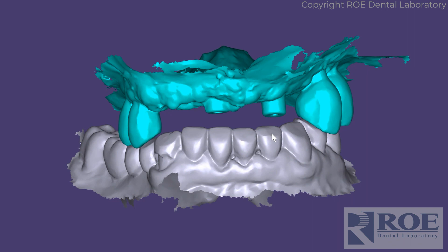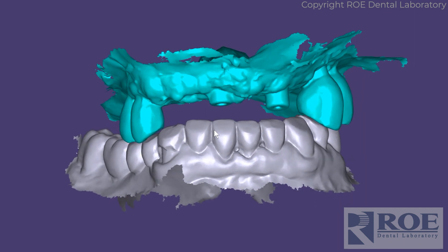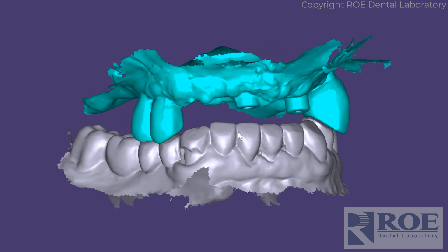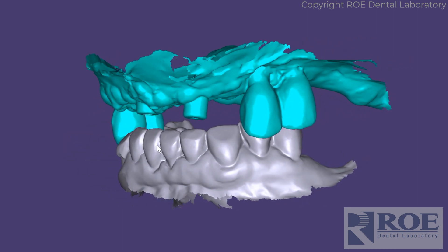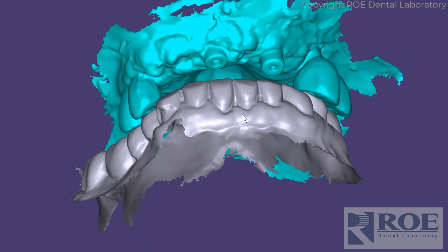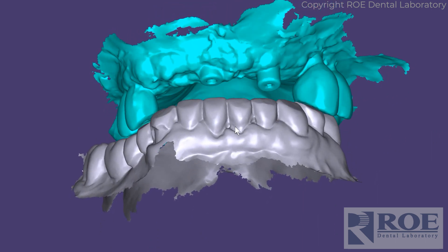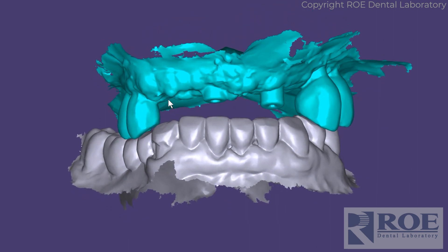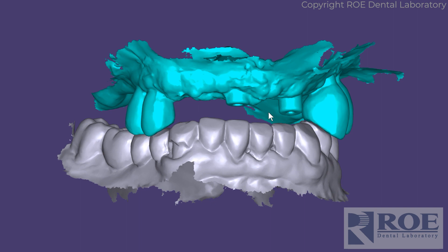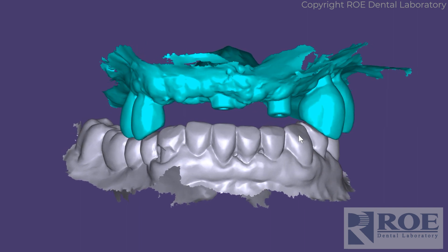This Grammature video is going to show the process of keeping the teeth as the constant. However, this case has a little bit of a twist. Normally, you would just capture the upper, lower, and the bite pre-op before starting surgery. This patient already has a couple of implants. You would capture the bite and then just move on and keep the teeth until the surgery is finished.